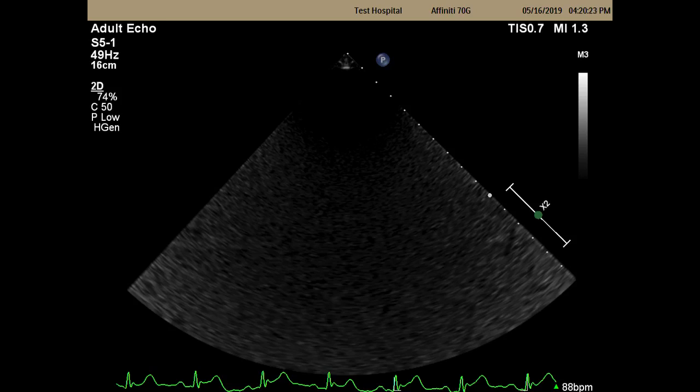It makes for a really nice picture in a journal or in a tweet or whatever you're going to use to talk about it. But really a lot of the meat of this is in the curves. The curves really let you know how each segment of the heart is doing over time. So without further ado, I'm going to scan our voluntold model, Dr. Harrison.